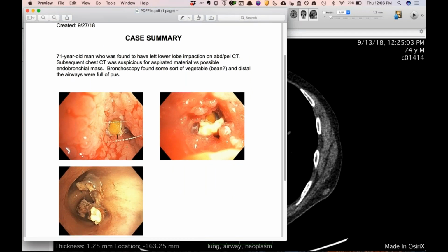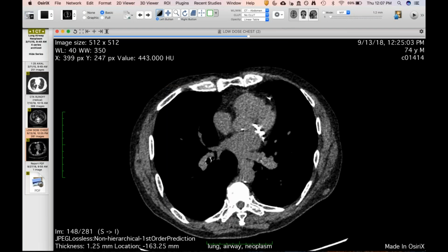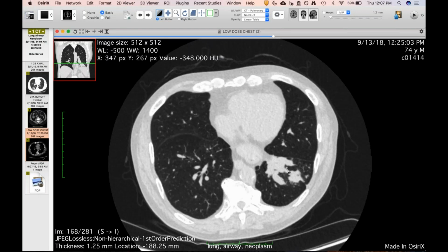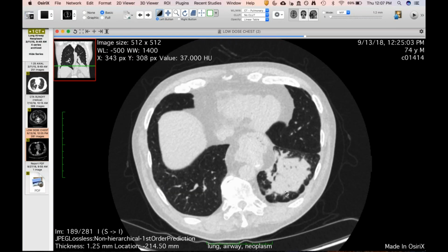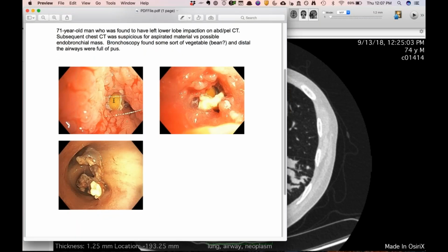And he said it was more green. It's just the picture makes it look a little bit more yellow, but some sort of bean or something in there. And once they took it out, there was a bunch of food beyond it. And he said he was impressed at how erythematous and thickened the airway was, and that all of this white stuff was basically just pus. They just kept aspirating more and more and more pus out of these airways. So I know Jeff usually is the best at getting the bronch pictures, but I wanted to show this just because I thought it was a nice correlate here.